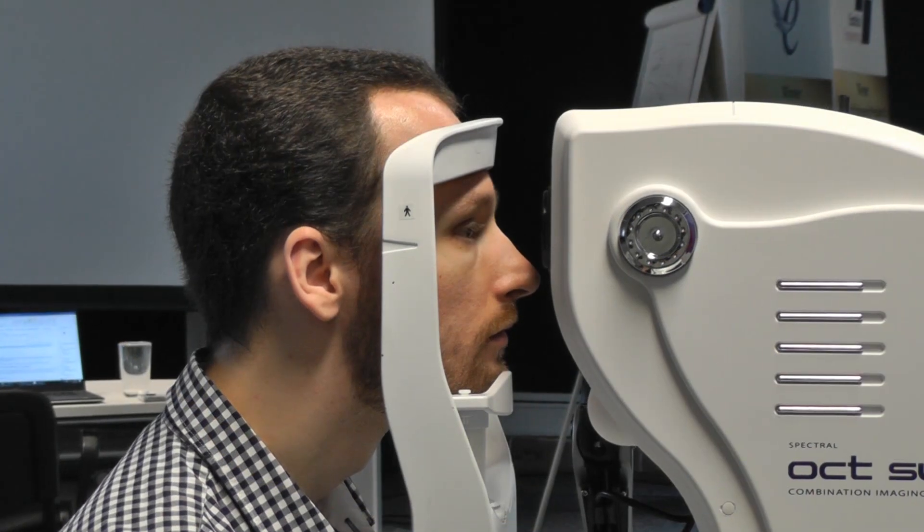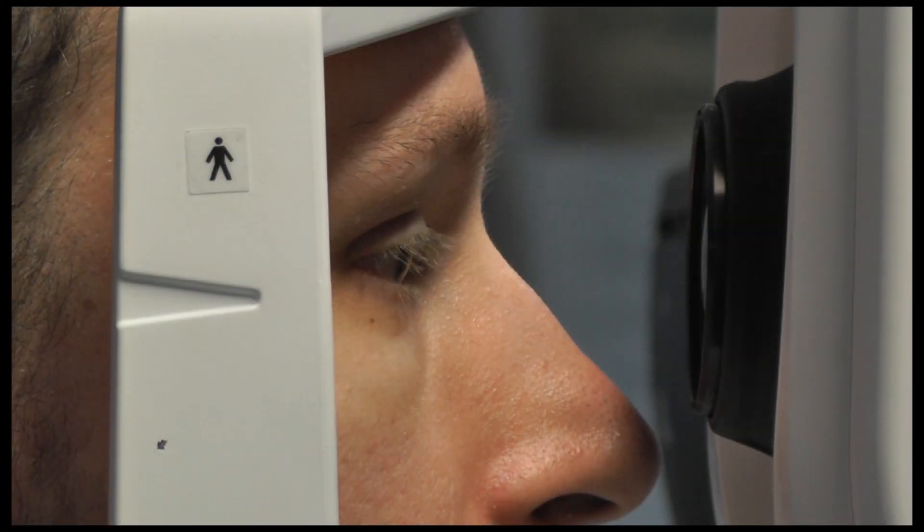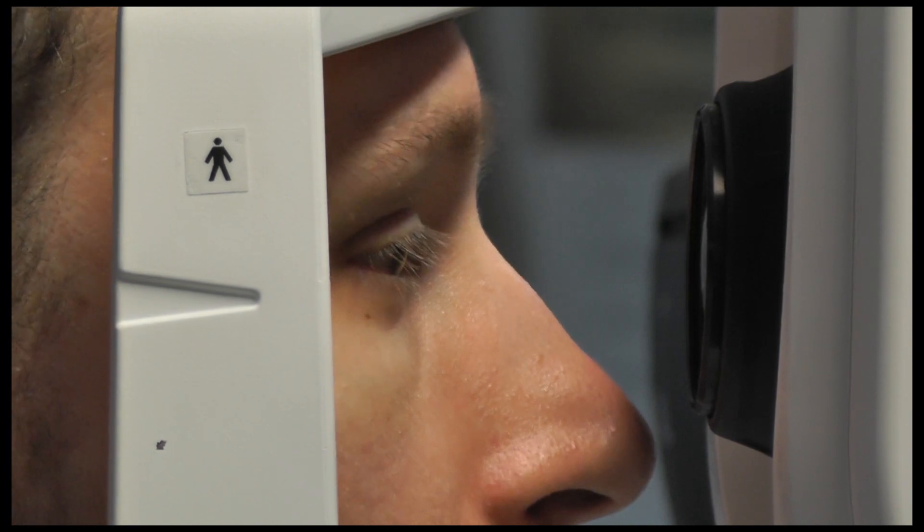Together with the OPTOS OCT research device, this enables us to take high-resolution images of both human and rodent eyes.